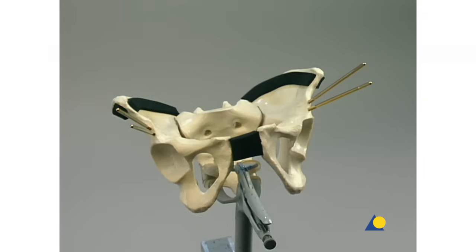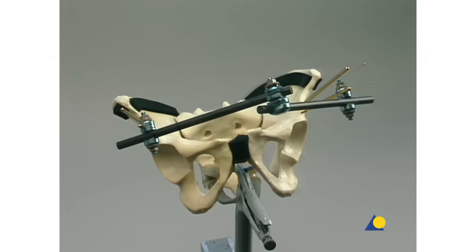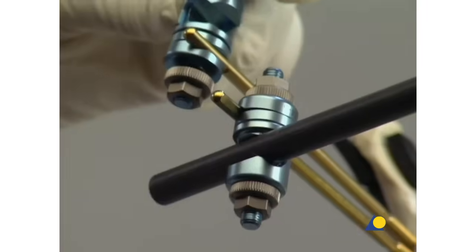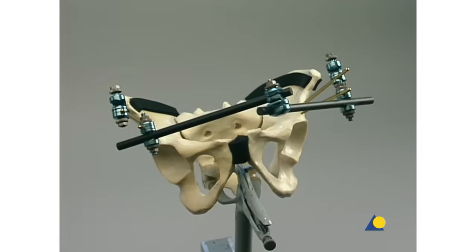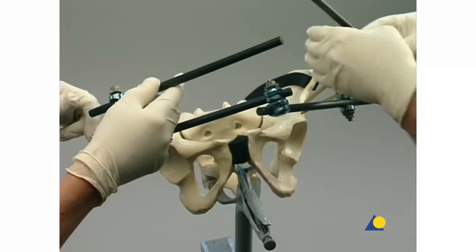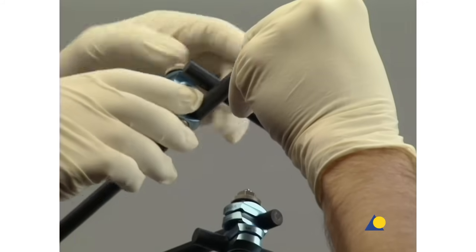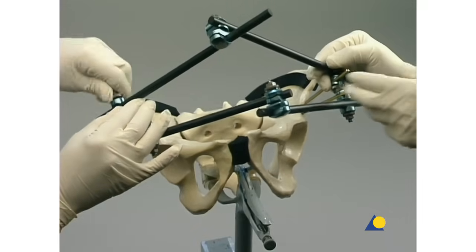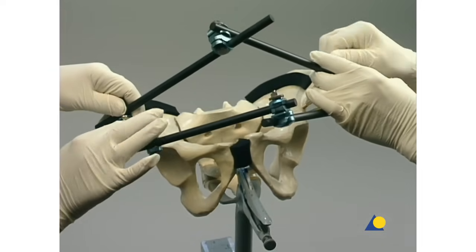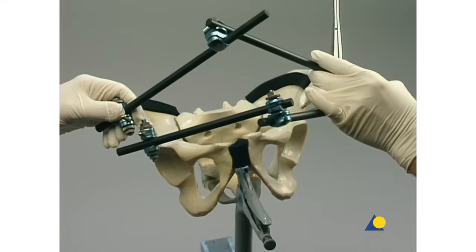Another screw is added to the contralateral side. Following the insertion of the Schantz screws and construction of the single frame, for increased stability a second frame is attached to the second set of Schantz screws. An open adjustable clamp is mounted on each of the Schantz screws. A carbon fiber rod is inserted into the open adjustable clamps, and the carbon fiber rods are connected with a combination clamp. The clamp nuts are first tightened by hand, then the socket wrench is used for provisional tightening.